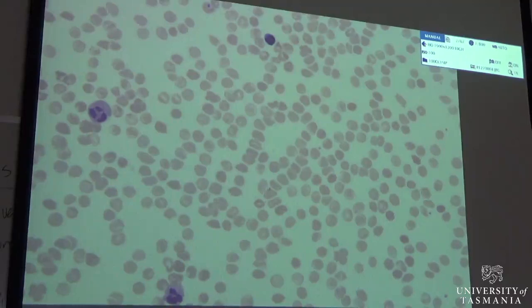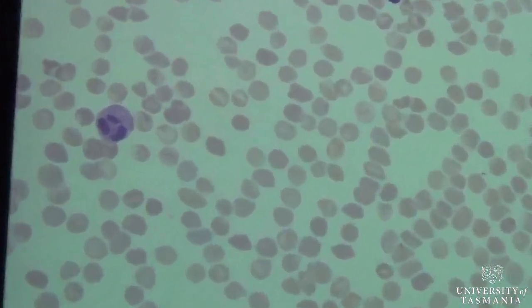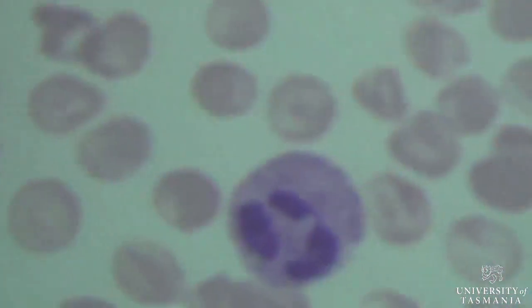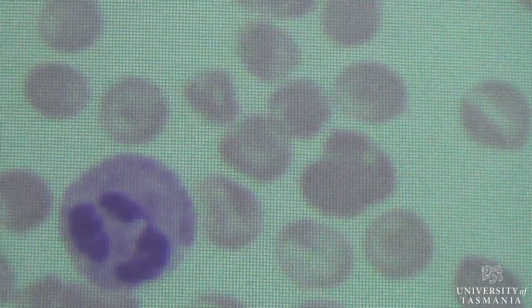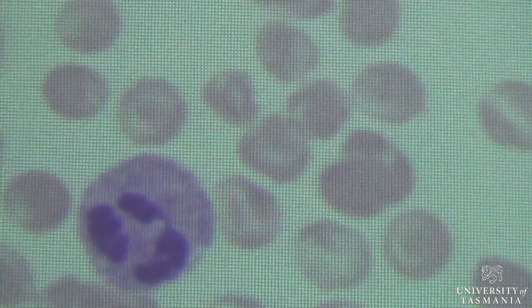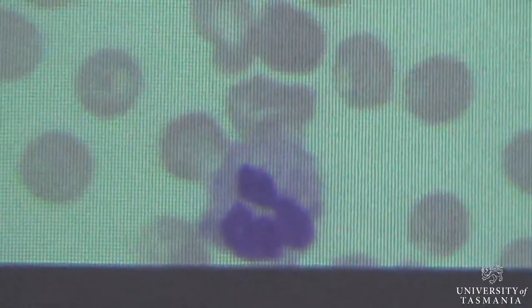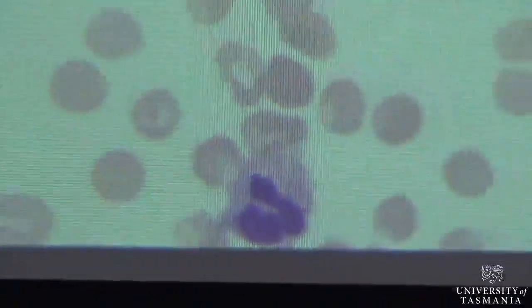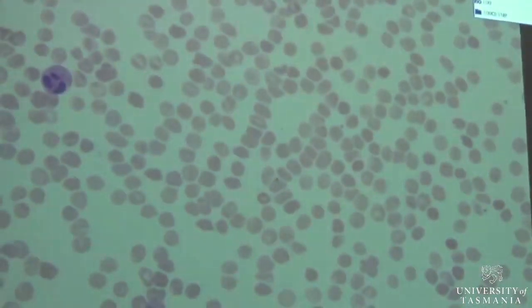You can see the granules very easily, and of course they are quite large, and this is what I refer to as my angry neutrophils or my upset neutrophils. So they're not toxic, but they certainly look different to normal, and that could just be that the cell membrane is a little bit thinner, or it's a different chemical constituency, and so the cells are staining a little bit differently.